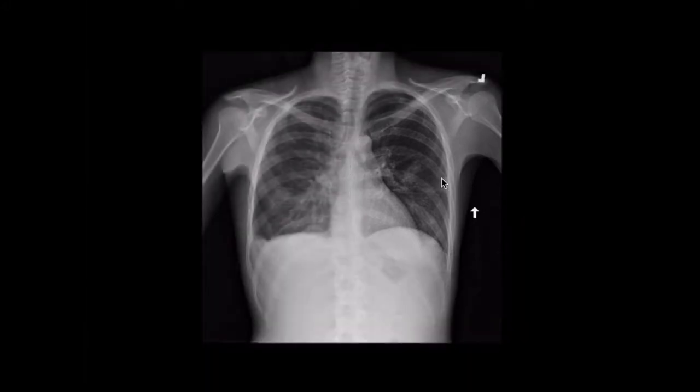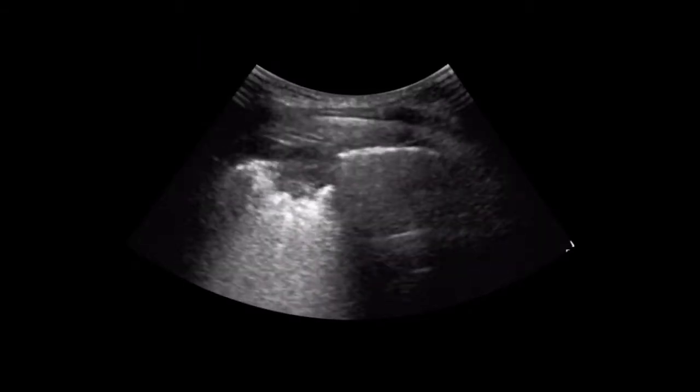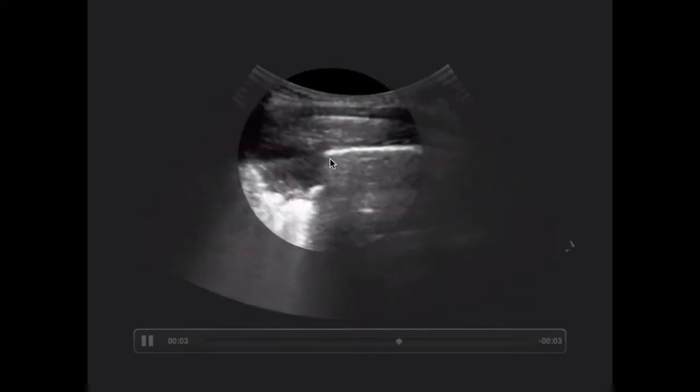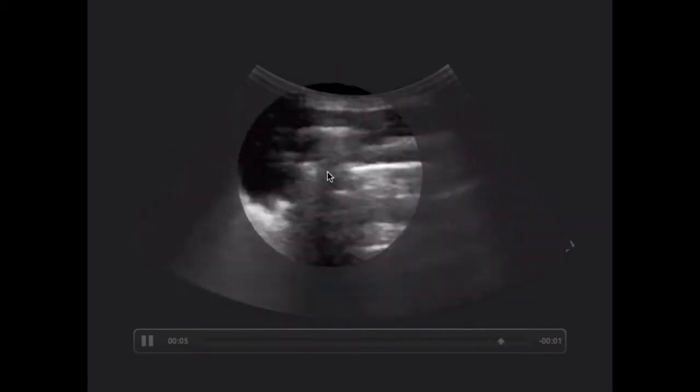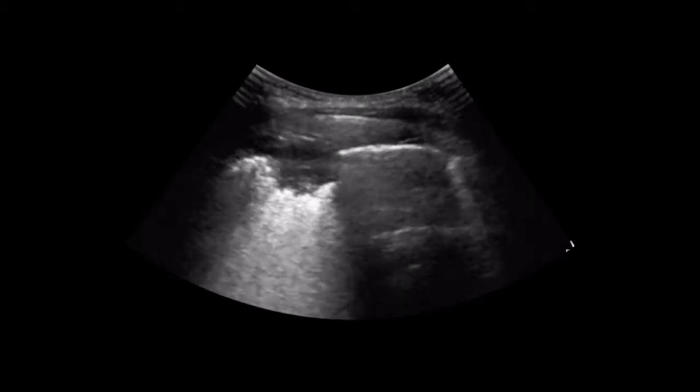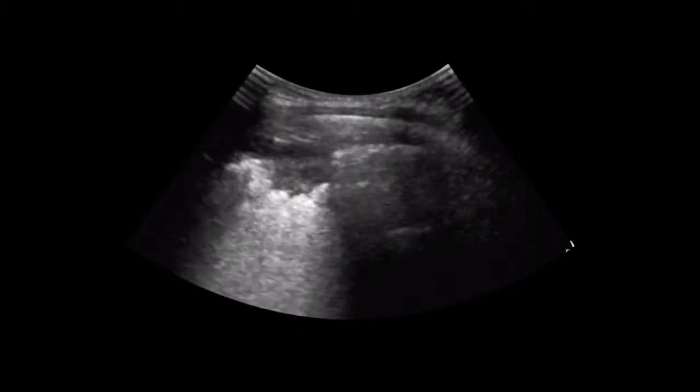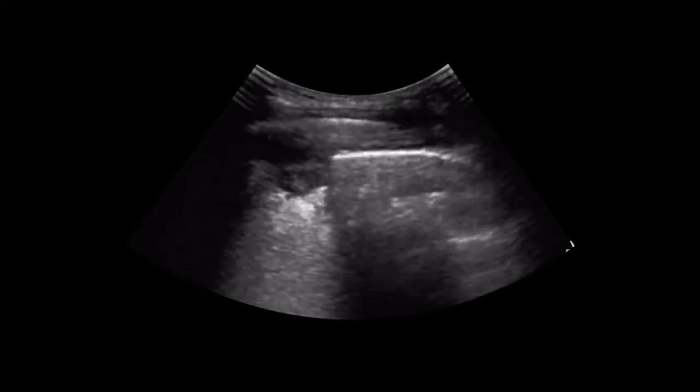This is a patient that had been given azithromycin for a multifocal pneumonia in the outpatient setting — obviously it didn't work. You can actually find septic emboli on ultrasound fairly frequently. You see that white line up here — this is a normal pleural line. You see this dip that happens right here? That is a septic embolus; some of us call that a sub-pleural consolidation. It's a little circular dip in that pleural line. If you see this in a patient you suspect might have endocarditis, this is how you diagnose it. I've had patients where I didn't really think it was endocarditis, found the septic emboli on ultrasound, and then looked at the heart and found the endocarditis.